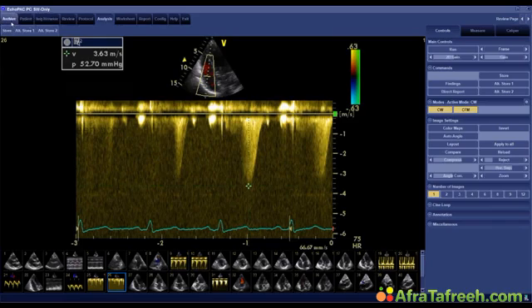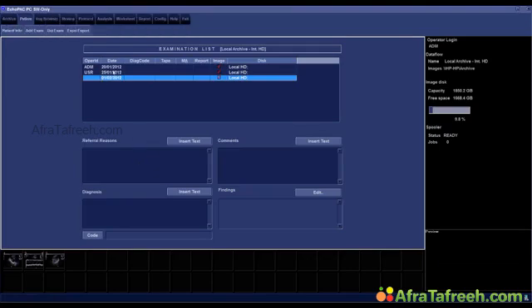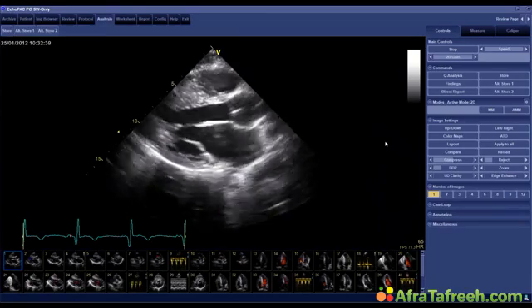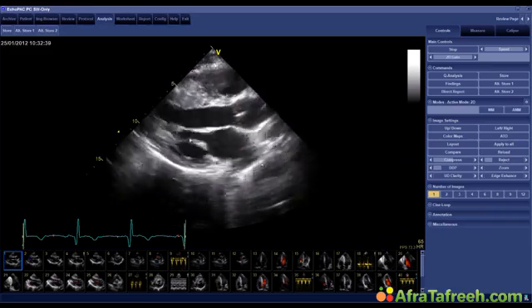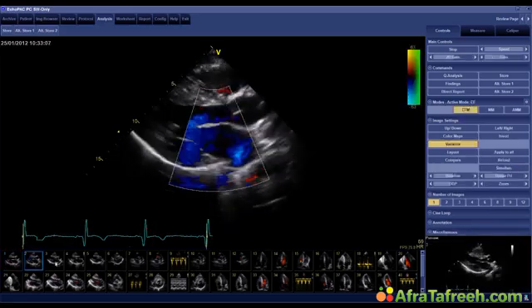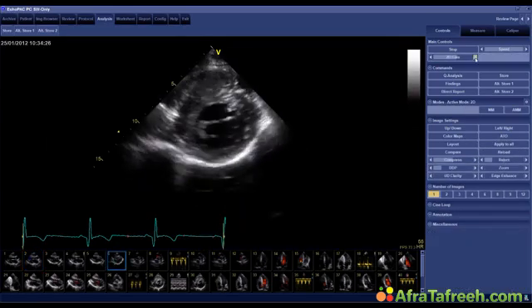Okay, so let me go into the archive here. So this is, I think most of you, when you see this echo, will immediately recognize what the diagnosis is here. But I want to show you a few features of the disease and just walk you through the information we can gather from this patient here. The first thing we see is massive left ventricular hypertrophy here. This is certainly much, much more than you would expect in anyone. You probably wouldn't even see such massive left ventricular hypertrophy in someone who has hypertension.